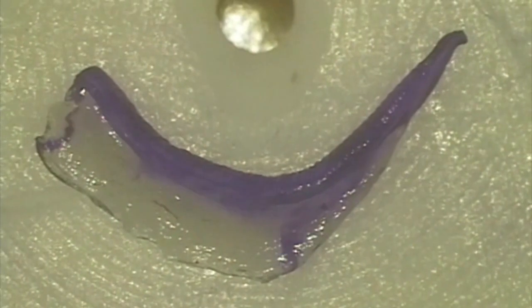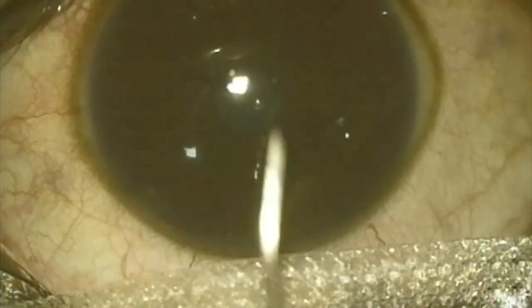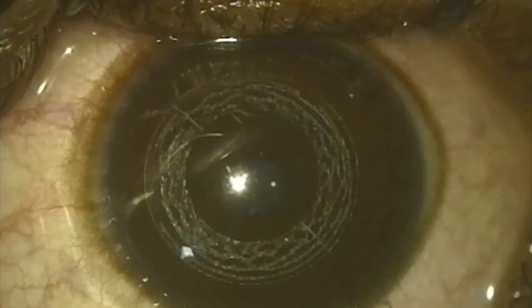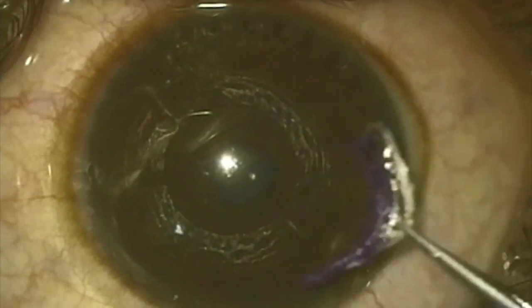I've been doing this for some time now and have presented my results in multiple meetings. You can have different kinds of customized segments, as I'll show later in this video. The patient's eye is marked and a femtosecond laser-dissected channel is created in the patient's eye. This circular intrastromal channel can also be created manually in those places where the femtosecond laser is not available.